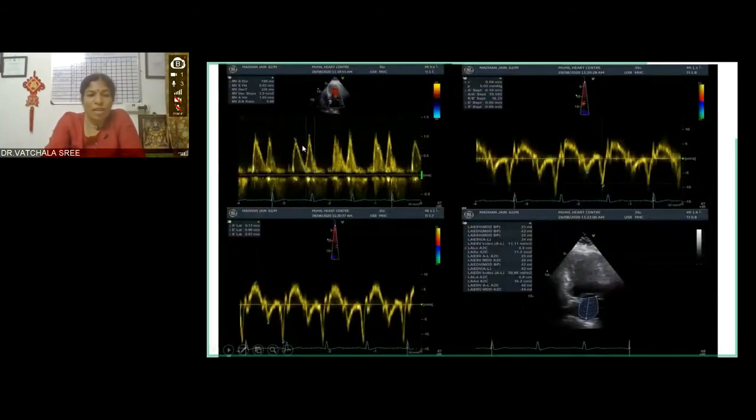Now, actually going into the mitral inflow pattern, you can see that the E and the A are of equal length. So earlier, if you had taken a little bit more time, probably this would have come shorter and taller, or this can also be fitting into the earlier criteria of pseudonormal, grade 2, where they say you do the Valsalva maneuver and then you identify.